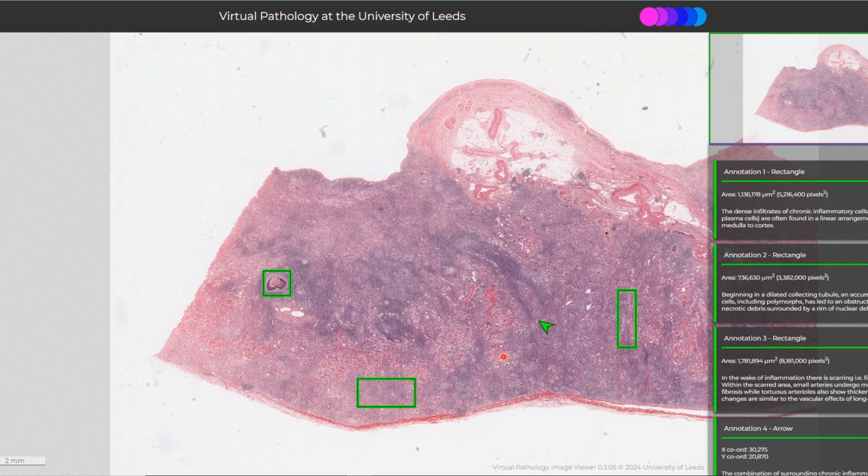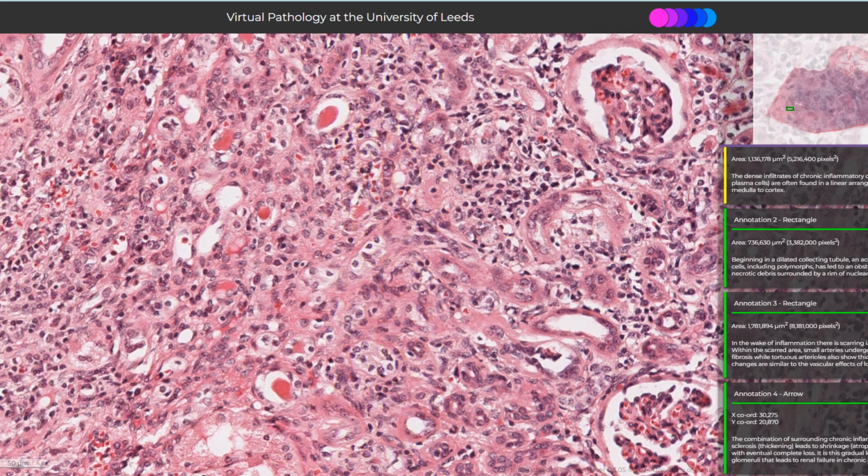The next one is chronic pyelonephritis. This is also again a very helpful slide which has annotations that you can look into. But most importantly, apart from this, the bluish things are basically inflammatory cells, lymphocytes. Okay, it's chronic lymphocytes. You should look into the tubules. Okay, not many of them, but you need to look into it.